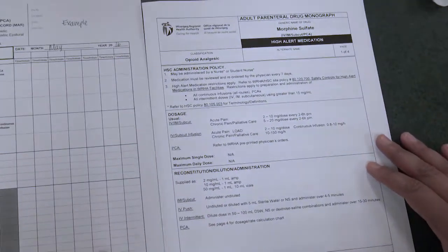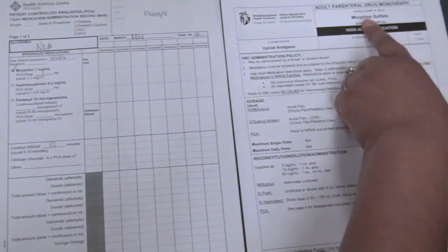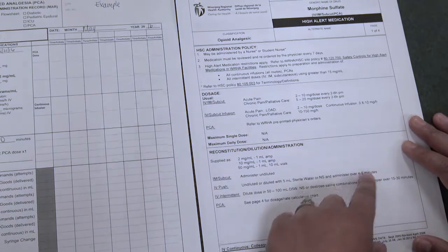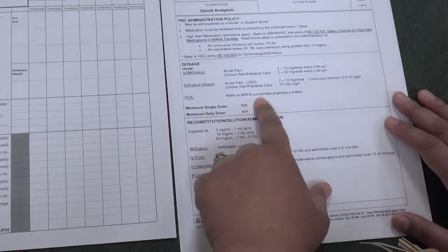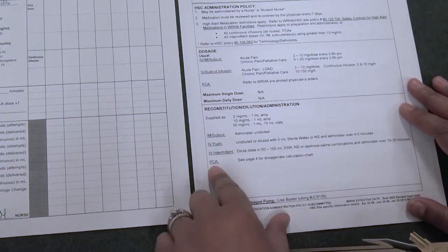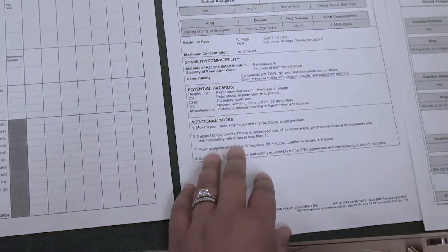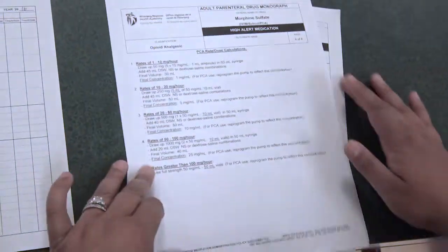For morphine, I'm looking at morphine, 1 milligram is my drug, and I have morphine sulfate. I want to make sure that I'm able to administer it, so it may be administered by a nurse or a student nurse, so I'm okay. Then you're looking at your dosages. For PCA, refer to WRHA pre-printed physician's orders. Down here it says for reconstitution and administration, PCA, see page 4 for dosage. So we're just going to flip. That's page 2, page 3, and page 4.